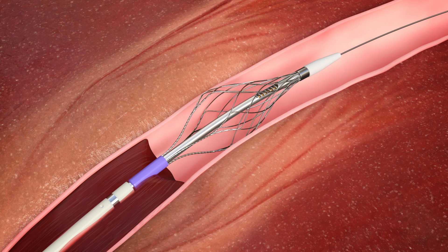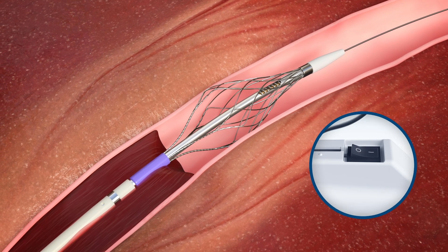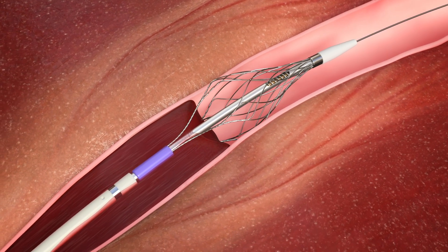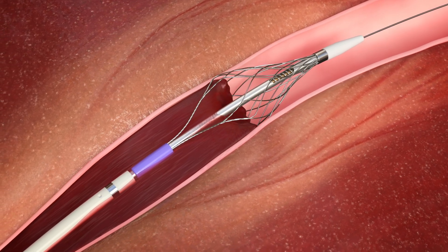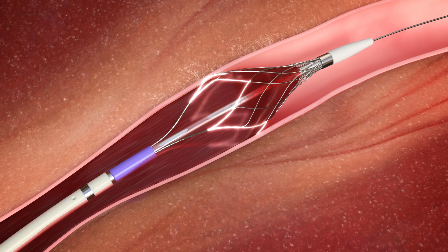A flip of the switch activates the Pounce Venous catheter's extraction screw, and the device is slowly retracted. As it is being withdrawn, the expanded basket engages, disrupts, and debulks clots of varying morphology while maintaining wall-to-wall vessel contact.